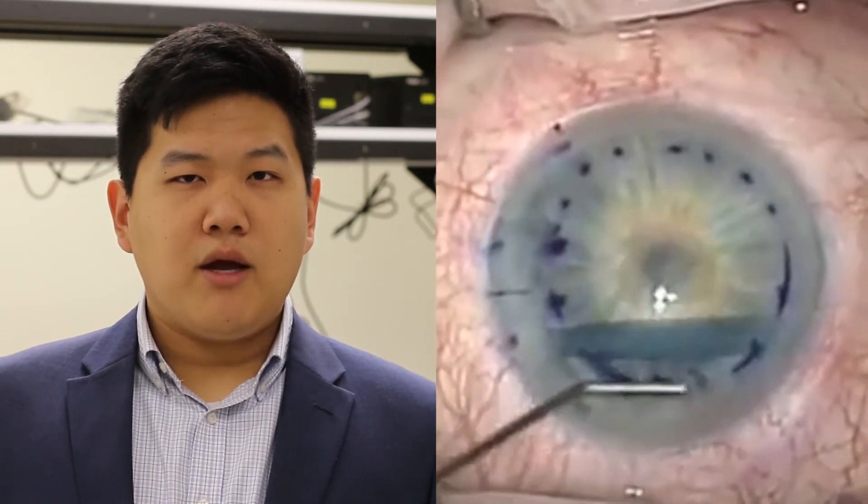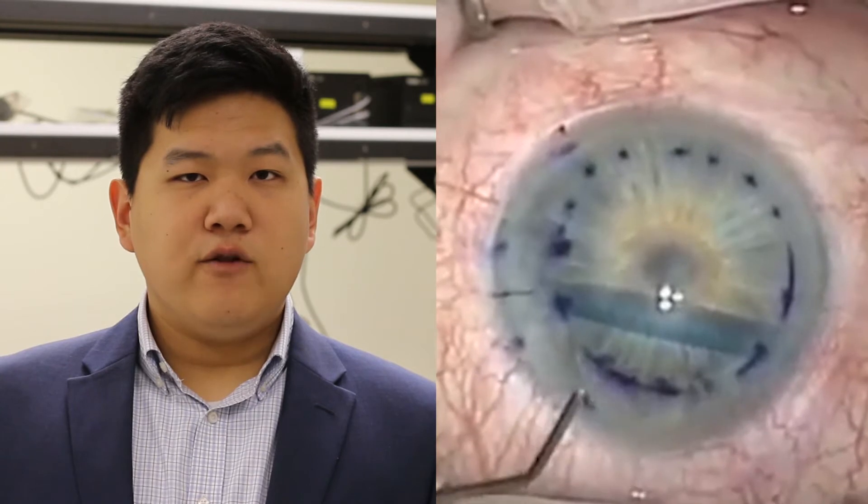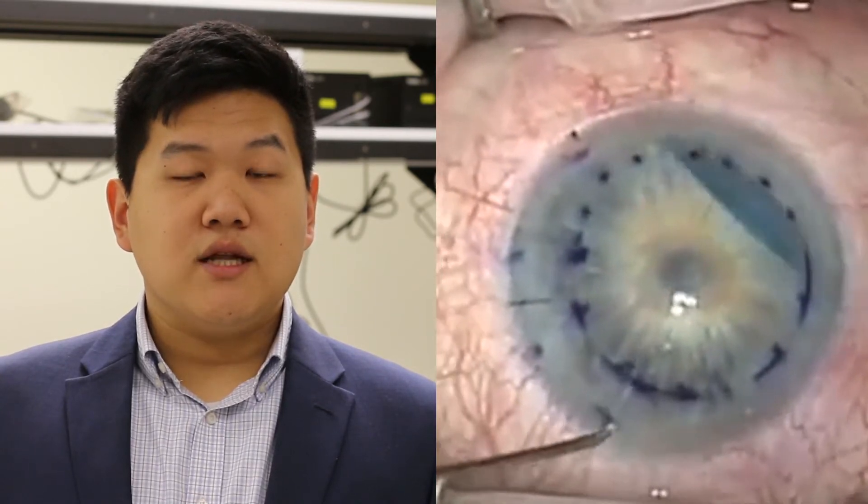To unscroll it, surgeons are currently limited to tapping on the cornea, using jets of fluid or bubbles, or using instruments alongside these approaches. We realized we can make a solution to this problem by introducing a novel workflow to eye bank technicians and by using the tri-fold technique.